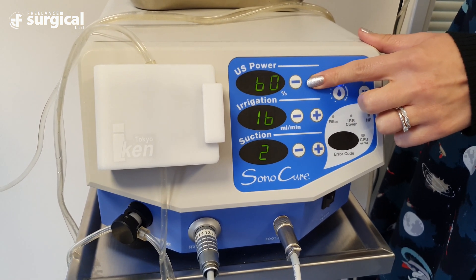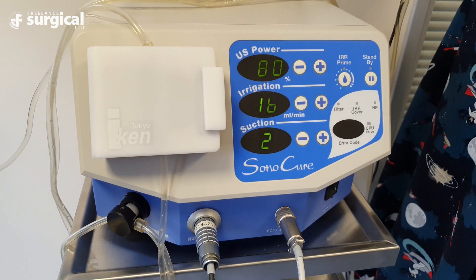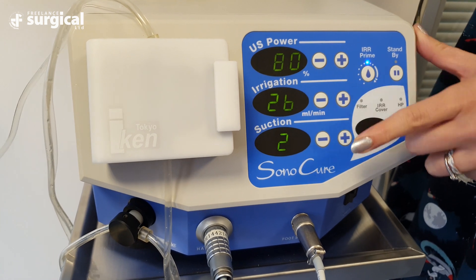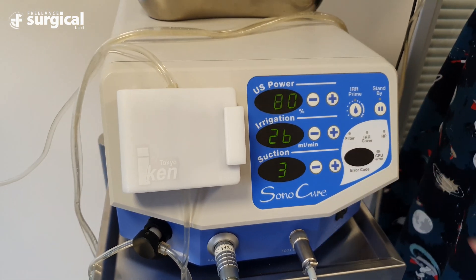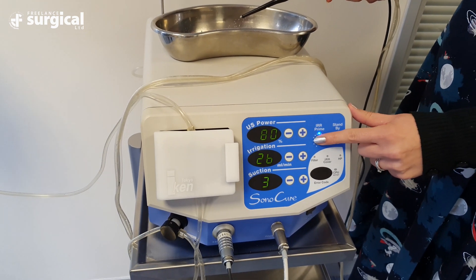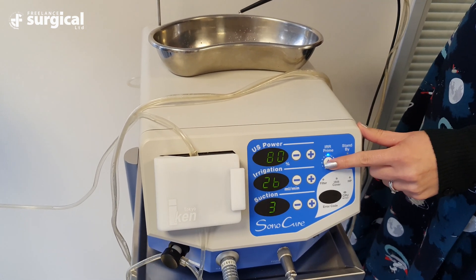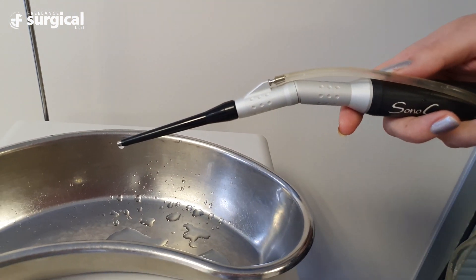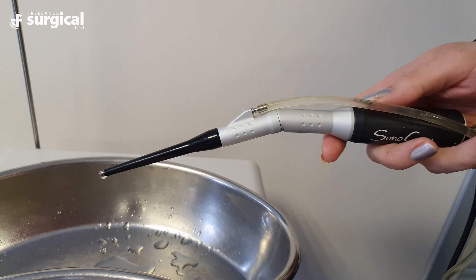Before surgery can begin with the Sonicure unit, the machine or the generator needs to be primed fully. With the generator switched on and the tubing attached to the fluid bag, press the prime button on the right hand side of the generator to run the sterile saline through the tubing to the handpiece. The handpiece is then ready to use.